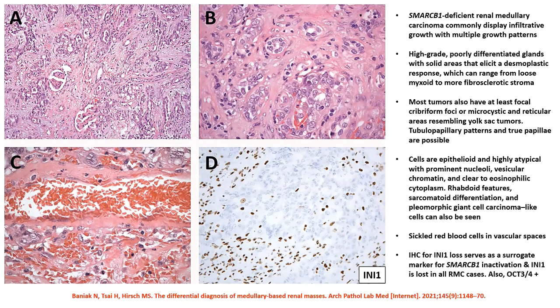just as you see in the case of a collecting duct carcinoma. Now, I've already said that these tumors are usually seen in patients with a sickle cell hemoglobinopathy. So that's a very important diagnostic clue. You have to look around within the blood vessels in the background, and you will see sickled RBCs within the blood vessels as well as in the stroma adjacent to these blood vessels, and that's an important diagnostic clue as well.